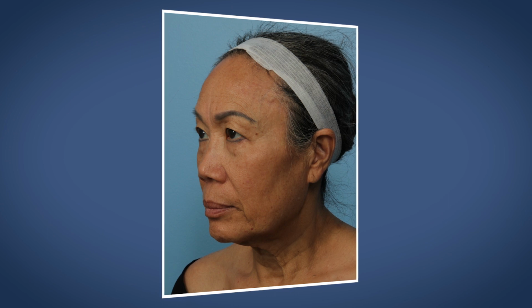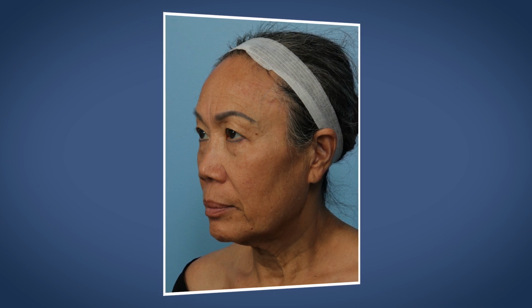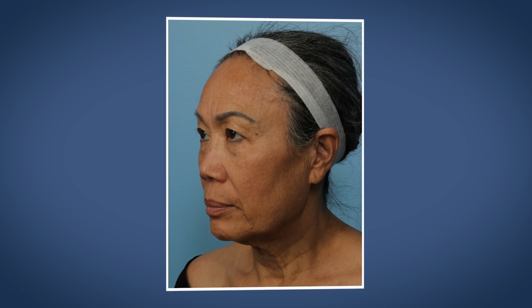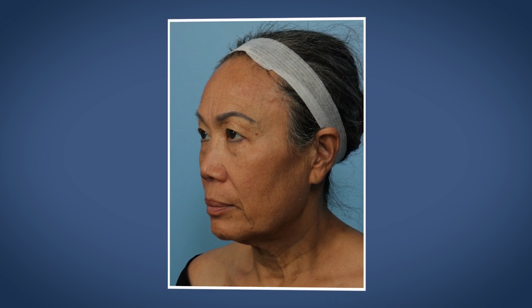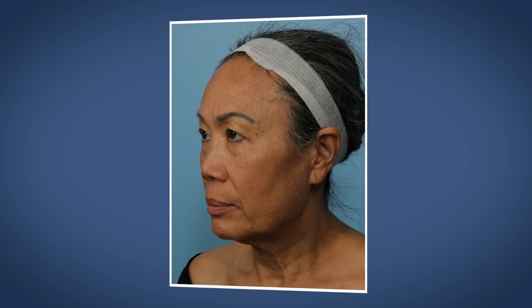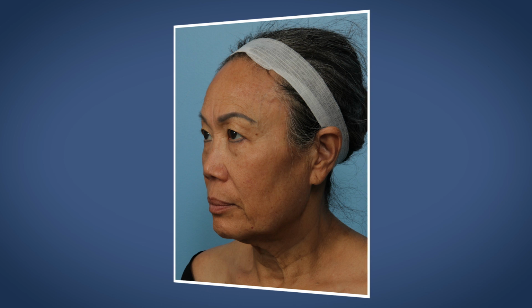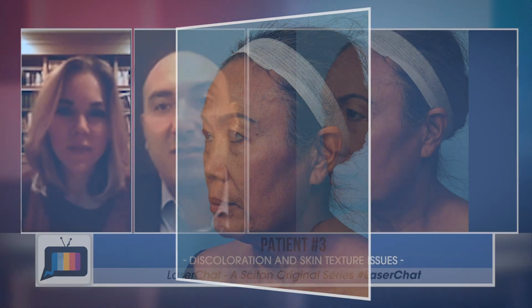Overall quality of her skin is very good. She doesn't have a lot of dyschromia. She doesn't have a lot of etched in lines. She just sort of has tired looking skin, is the term that I use. Things that catch my eye that many other people are not treating are the reticular veins there on the temple. And the Clear V is something that I've really enjoyed for getting to these veins that are just too deep for anything other than the 1064.